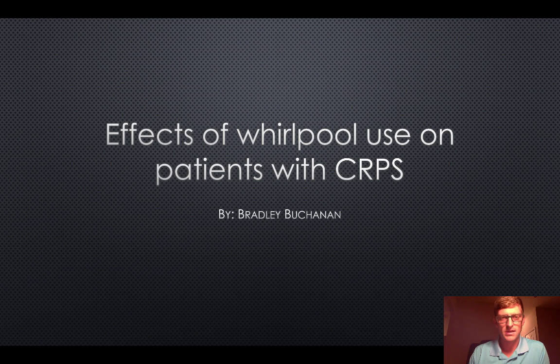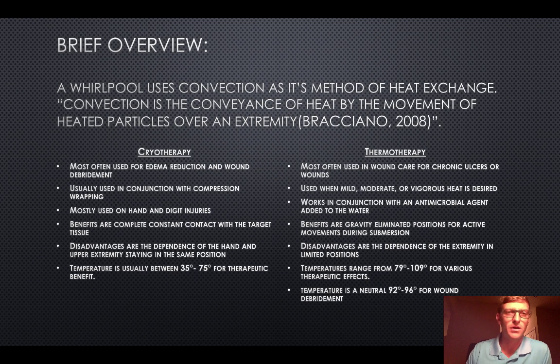Today we are going to be going over a specific article that's called the effects of Whirlpool bath and neuromuscular electrical stimulation on complex regional pain syndrome. It was a comparative study. But before we get into all of that, I'm just going to give you a brief overview of how we use Whirlpool therapy in our practice.